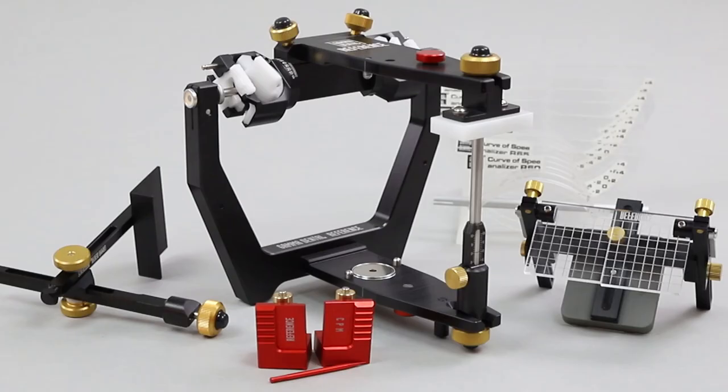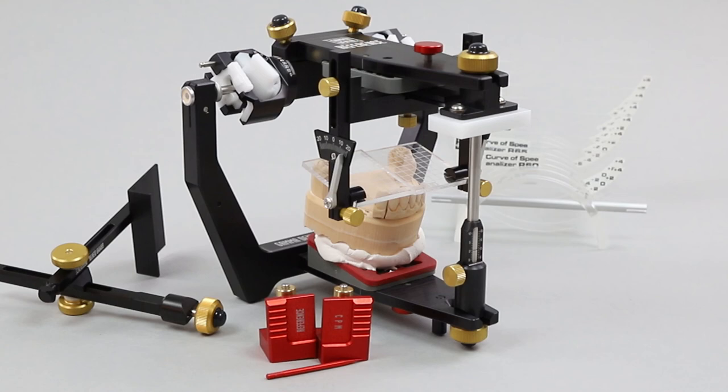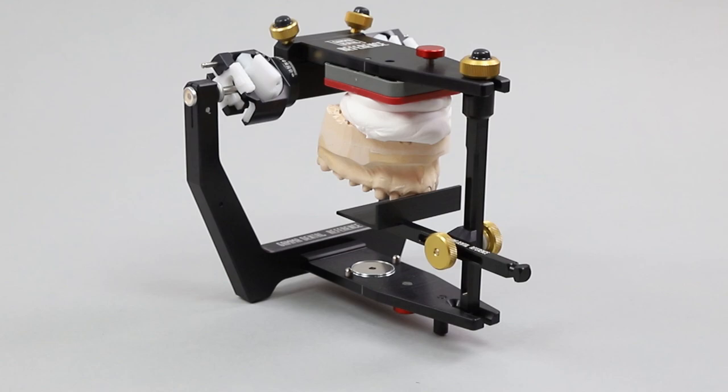The articulator can be utilized and expanded for many more features. For example, occlusion measurement, curve of Spee measurement, condyle position measures, and anterior guide measurement.